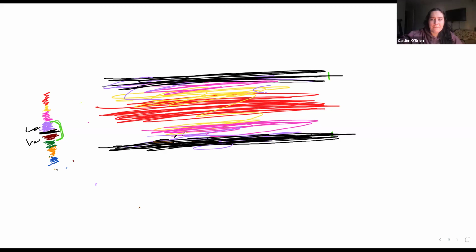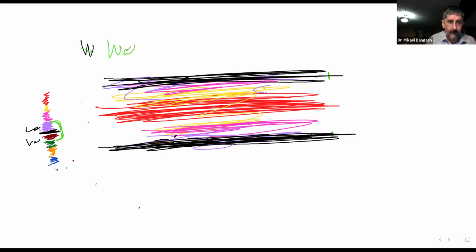So guys, what does the wall filter do? Its main function is just like reject. What did reject do? It eliminated the low intensity signals. But here it's not intensity.